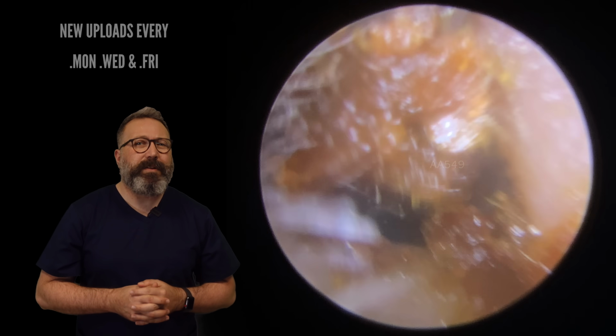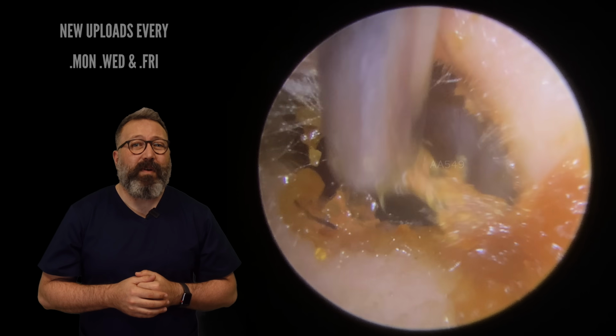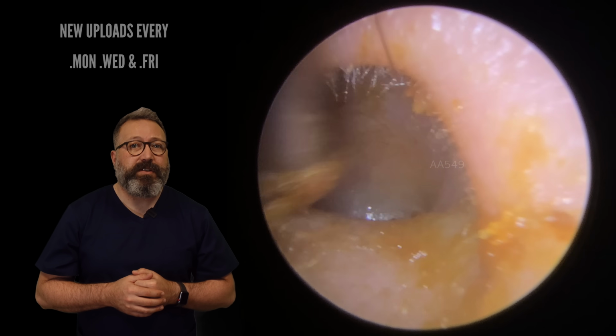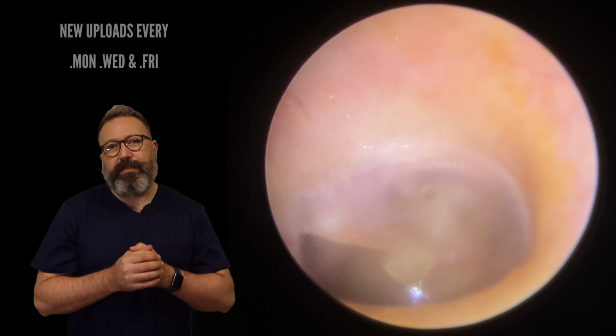But the patient did have a little bit of tenderness to the ear on this side. So they couldn't lay on that ear. And I think that's just because the sheer volume of wax in there was pressing against the canal wall, which can feel quite uncomfortable. So just tidying up some of the looser bits, just a bit of hoovering up there. And there's the eardrum looking nice and healthy on that one.